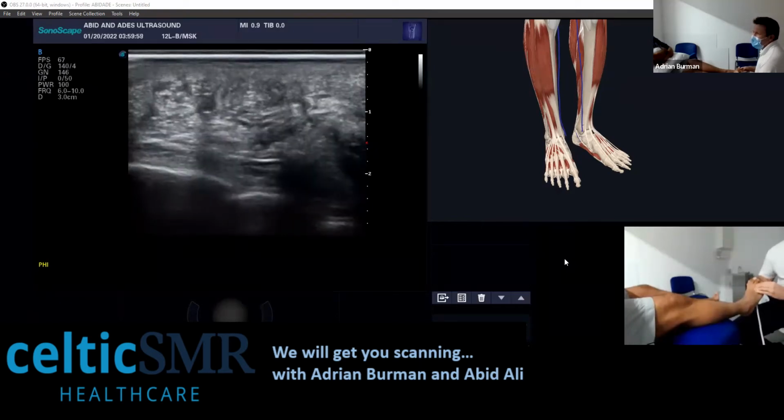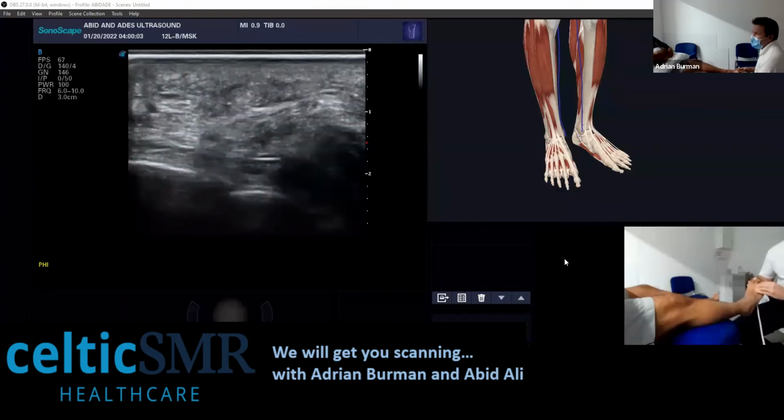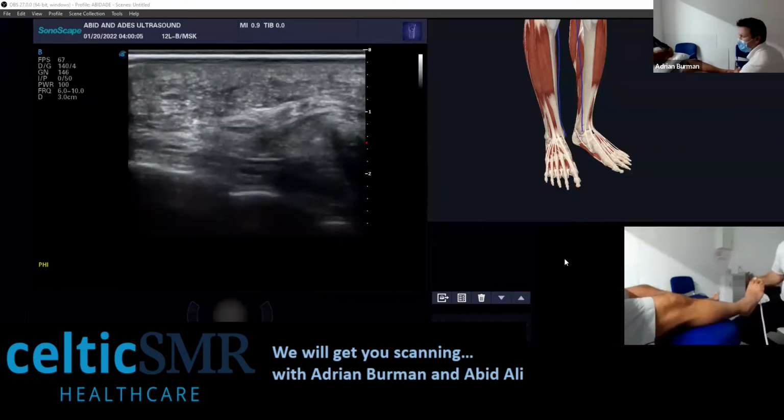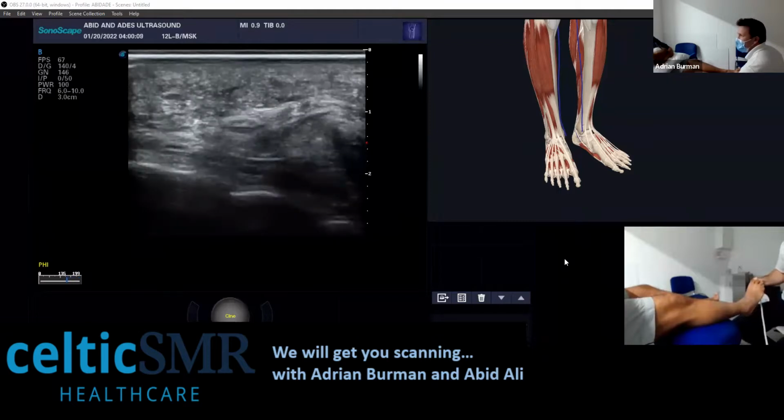Okay, and there's nothing in there I can see. And you can see a bit of the nerve going across there. There's nothing in there. That's pretty painful. That's pretty sore too. Is it? Yeah. Some neuromas are pretty angry, aren't they? So sometimes there's lots of nerve things coming and going through.